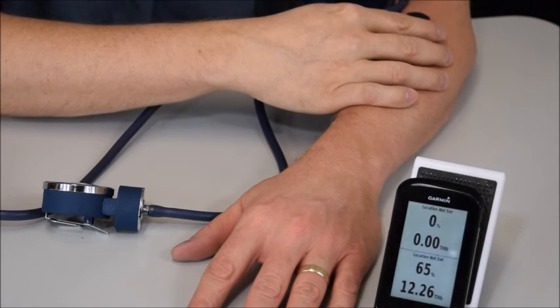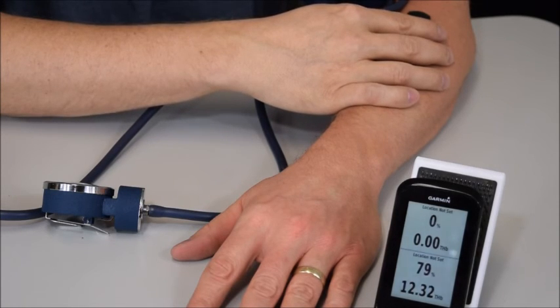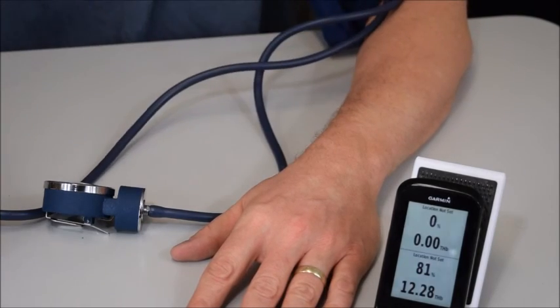And we can see the SmO2 climbing up on the competitive device. So it does move in the right direction. It's just that the magnitude is a lot smaller than on the Moxie because the algorithm is less sophisticated in handling the layers of the tissue. So it moved up 20-some points here, from a cuff occlusion to the hyperemic response.